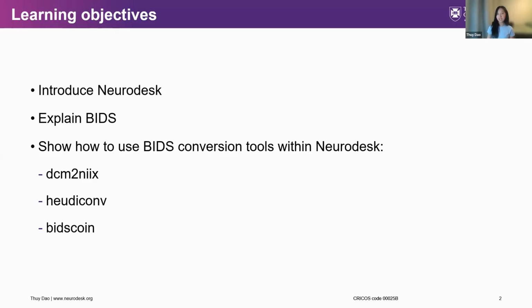And hopefully by the end of this talk, you will learn about these tools within Neurodesk and how to decide which one is right for your data and also for your skill set.